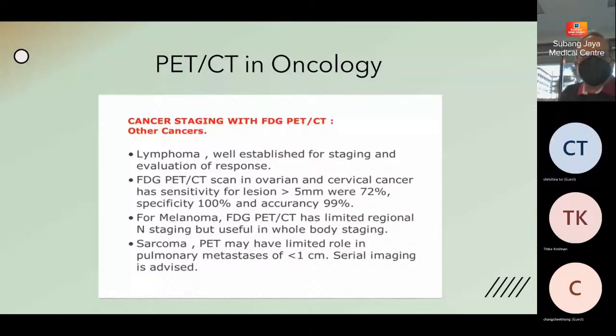Quantitative imaging systems, we can actually distinguish responders from those who are resistant to treatment, and it allows us to modify the treatment accordingly in the middle of the treatment. And you can't use just the PET alone. You look at how the symptoms are reduced after the initiation of treatment, and how the response is in terms of disease-free survival, progression-free survival, and overall survival. Laboratory parameters have to correlate with the PET scan images.